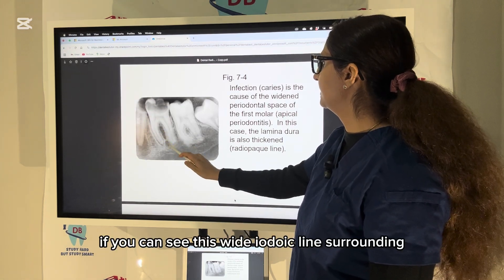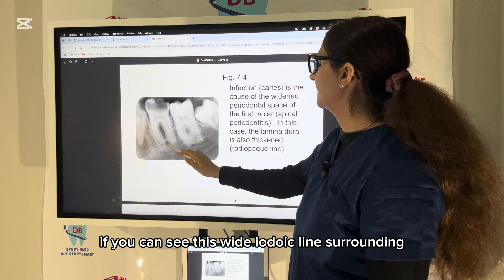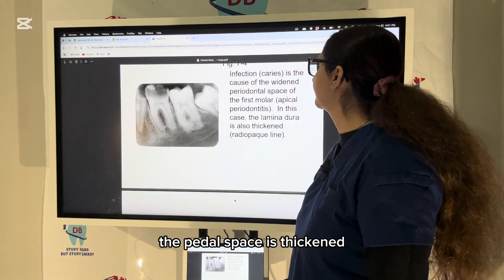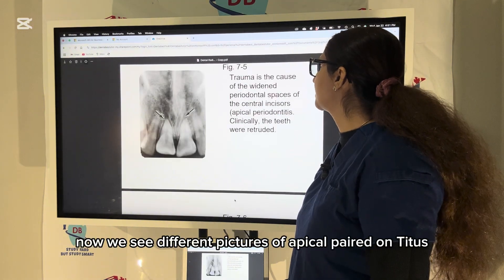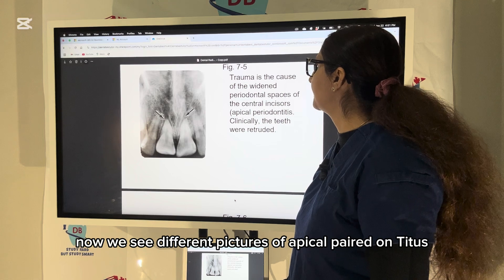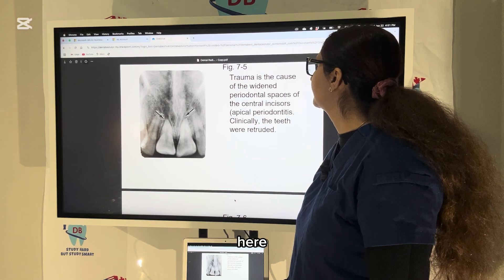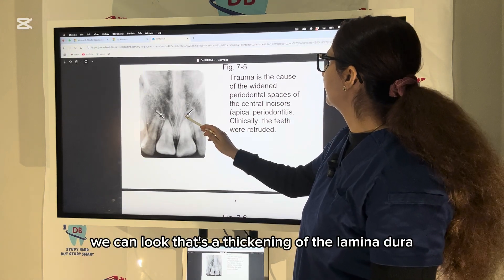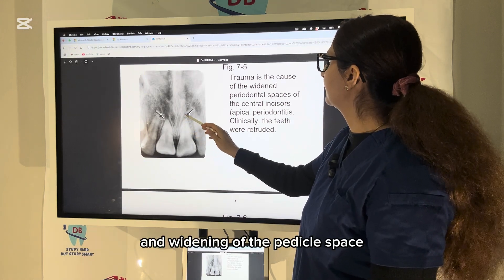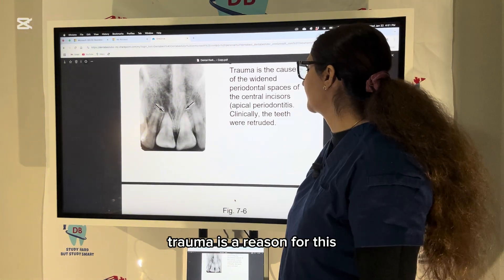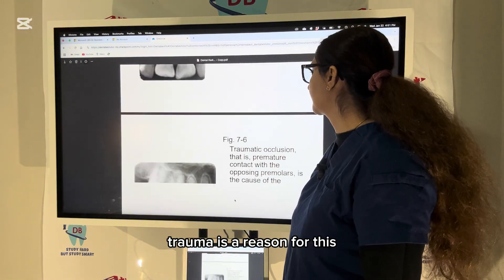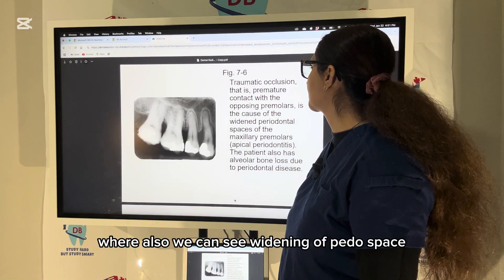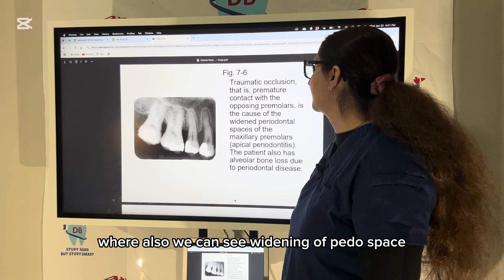Here you can see the widening of the periodontal space very clearly, and the lamina dura — the wide radiopaque line surrounding the periodontal space — is thickened. We see different pictures of apical periodontitis: thickening of the lamina dura and widening of the periodontal space. Trauma is a reason for this; traumatic occlusion also causes widening of the periodontal space.